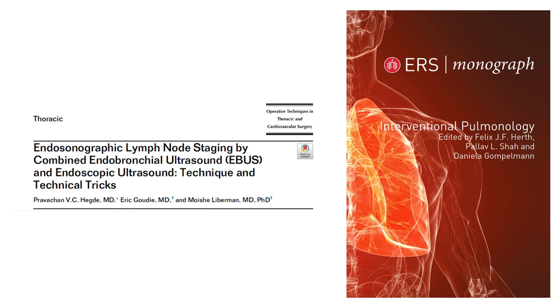Gotcha. So, Dr. Hegde, as we move towards the end of this recording, what parting advice or instruction would you give our listeners who are interested in performing this technique, that would want to improve their patient care but make sure that they do it safely? Yeah, first thing is getting familiar with the anatomy, and those sequential landmarks, the 6 landmarks starting off. Identify the liver, aorta, celiac axis, left adrenal gland, station 7, 4L and 4R. Simulator based training may help as well.